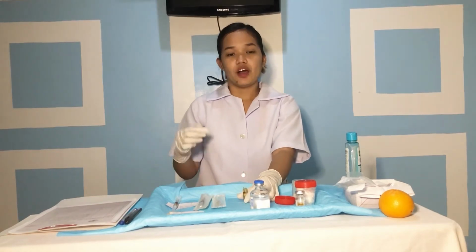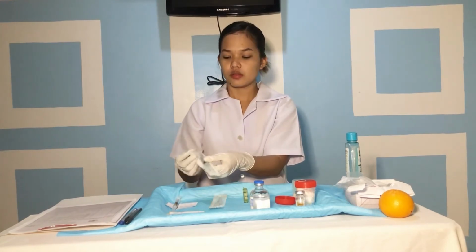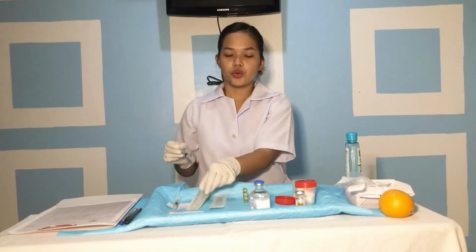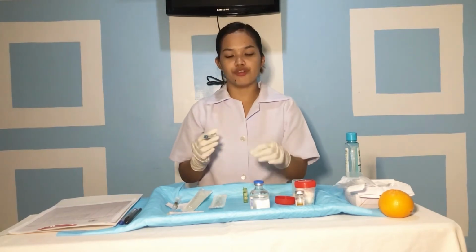We draw up medication quickly, using a needle long enough to reach the bottom of the ampule. The system is open to air contamination, so the needle needs to be long enough to access the medication for preparation. Filter needles filter out any fragments of glass.